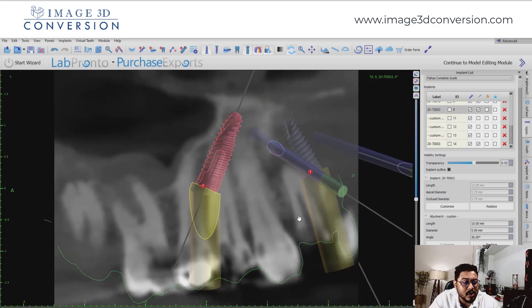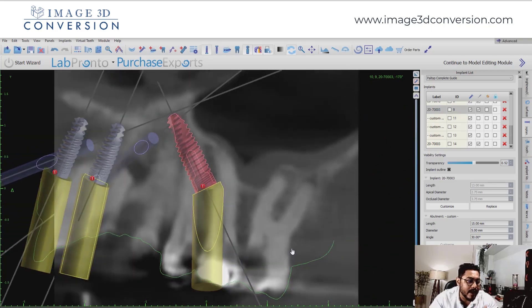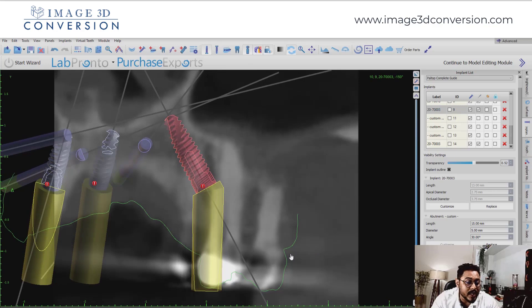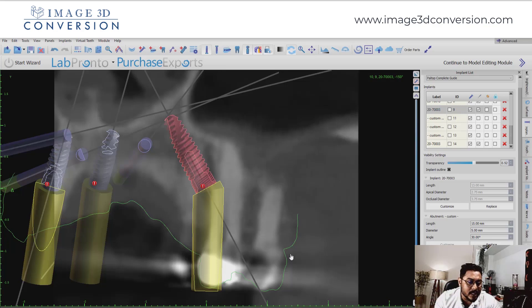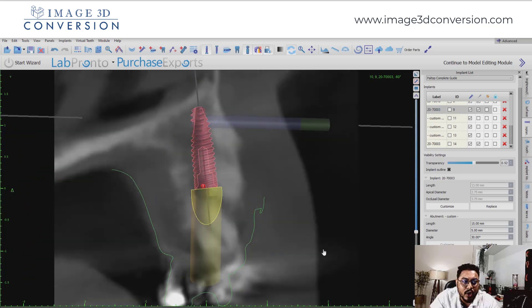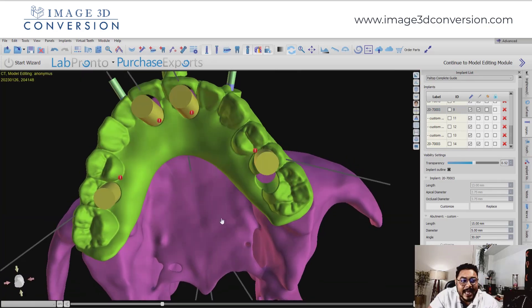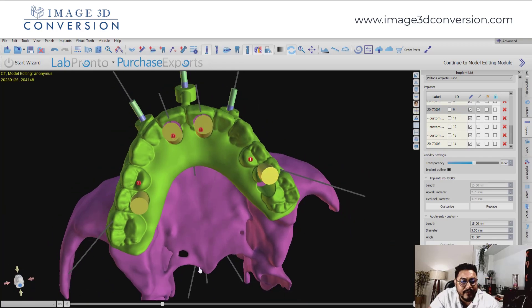The principal window is the tangential window — a 360-degree window in the software. You just scroll your mouse to verify the interproximal relations of the implant: whether the implant is contacting any vital structure, engaging with the sinus floor or cortical plate, or adjacent implants. For any kind of interproximal relationship verification, we always use this tangential window.